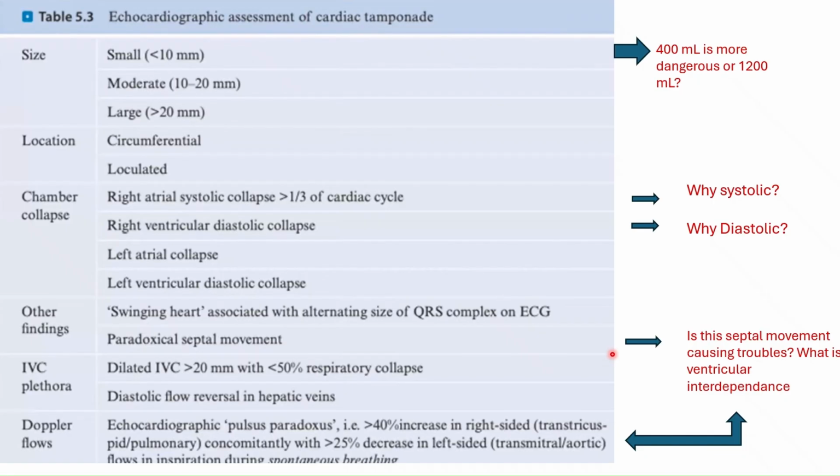So all this blood should go somewhere else. What happens is that this large amount of blood in your right ventricle is bowing and pressing your septum, so it pushes the septum towards the left ventricle. So you are technically creating a left ventricular filling problem and eventually left ventricular outflow tract obstruction.